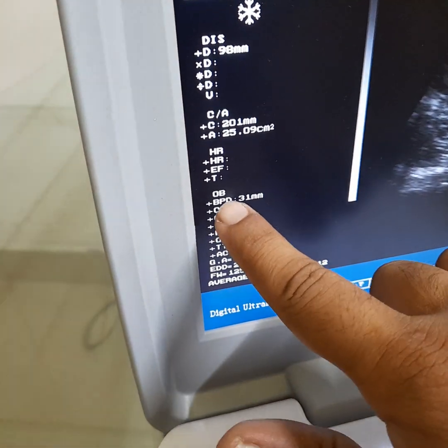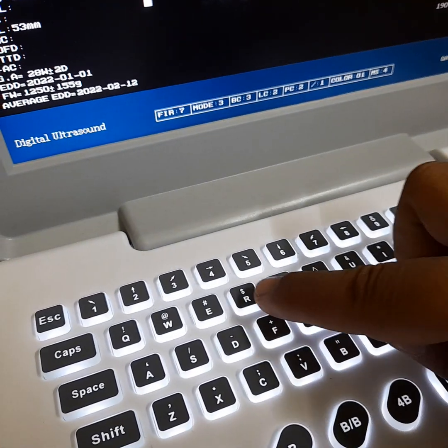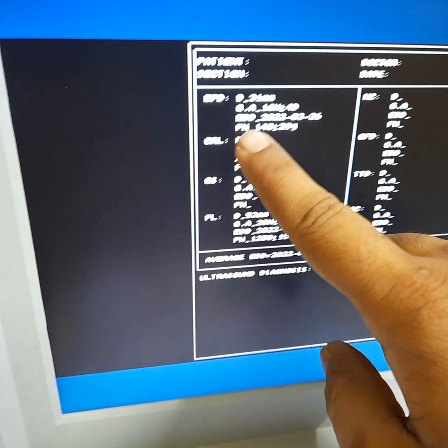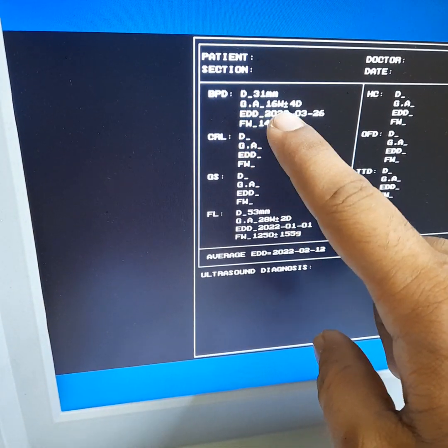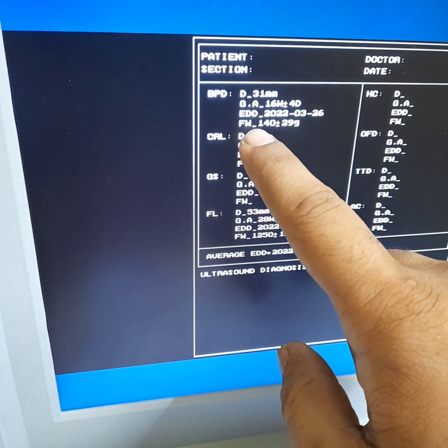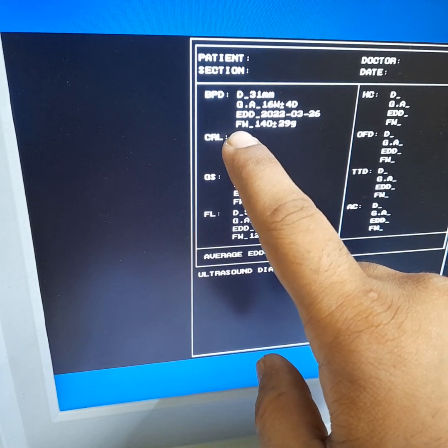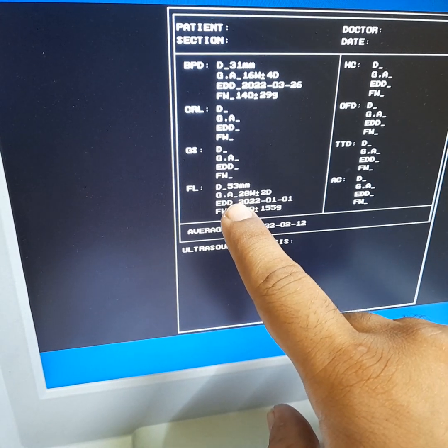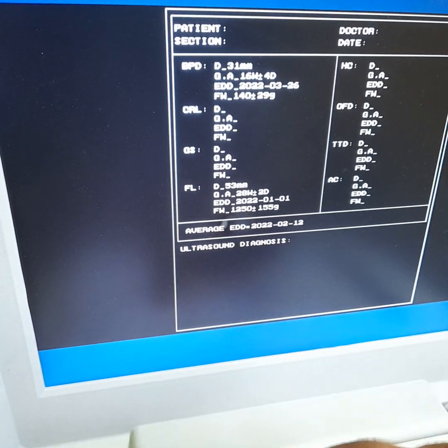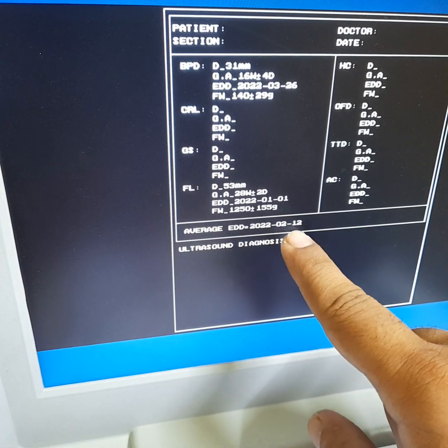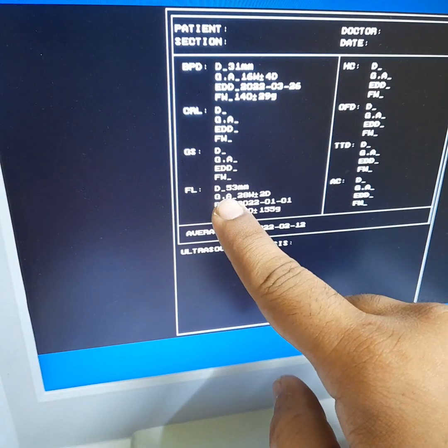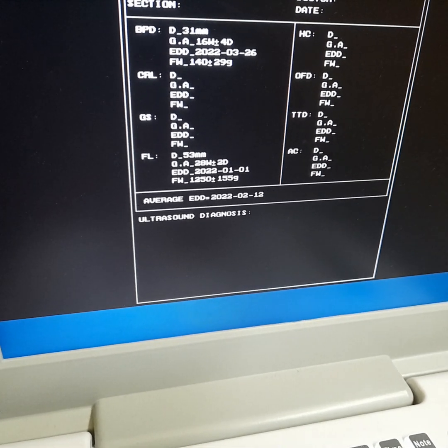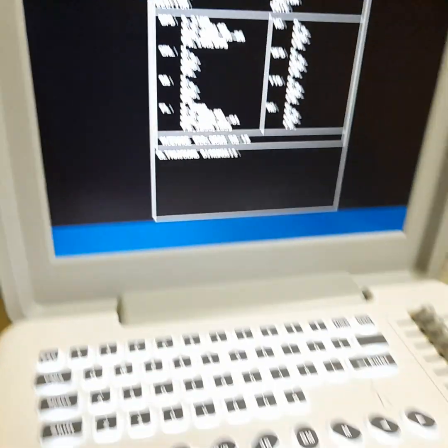We have now measured two values: BPD and femur length. Press the R button to open the report. The report shows: distance 31mm, gestational age 16 weeks, EDD, femur weeks, fetal weight, and femur length. The gestational age and average EDD are based on the average of the two measured values — BPD and femur length. We did not measure any other methods; these are the basic measurements.